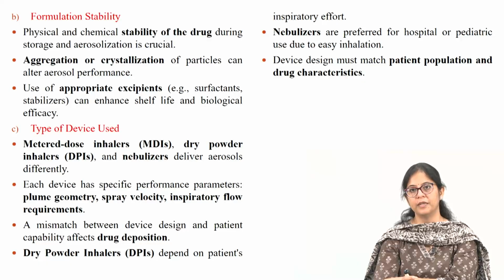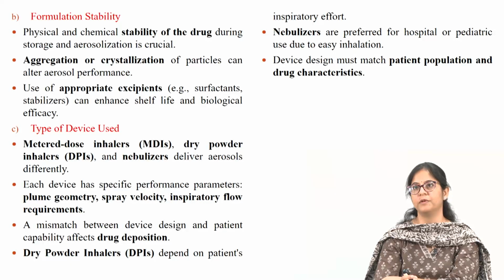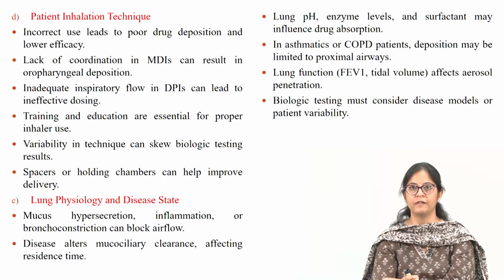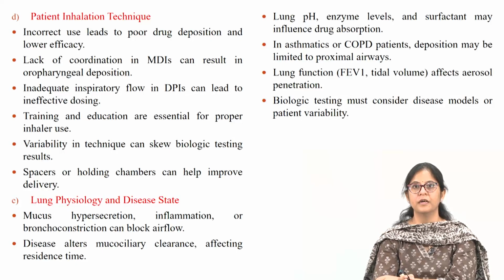The dry powder inhalers depend on the patient's inspiratory effort. Nebulizers are preferred for hospital or pediatric use due to easy inhalation. Device design must thus match the patient population and the drug characteristics. The patient inhalation technique also matters: incorrect use leads to poor drug deposition and lower efficacy. Lack of coordination in MDIs can result in oropharyngeal deposition.